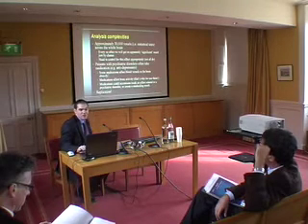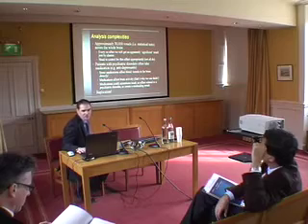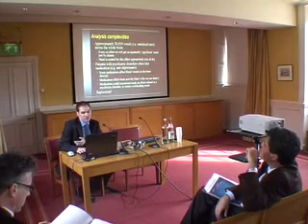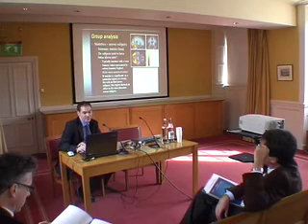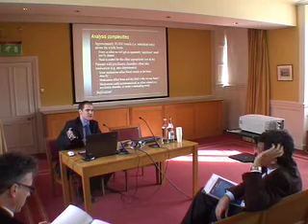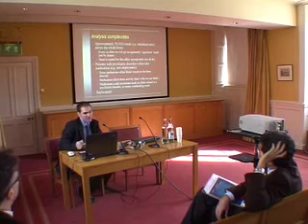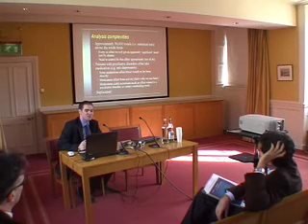So, what are the complexities? Well, the first complexity to notice is that, of course, we've got 30,000 measurements going on normally. So if we've got 3 by 3 by 3 millimeter voxels, you can probably just about see the little squares there. And each of those is actually a separate measurement. So if we take a given statistical threshold, like a 5% false positive rate, p of 0.05, that means every so often we're going to get what looks like an apparently significant result just by chance.